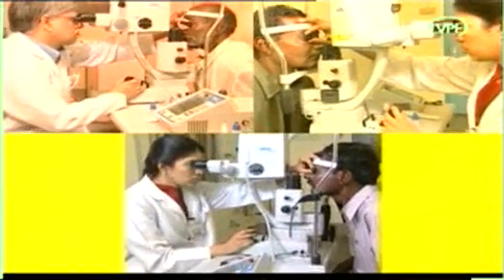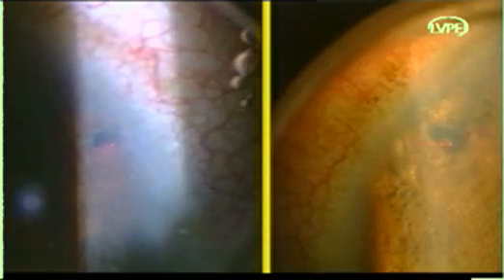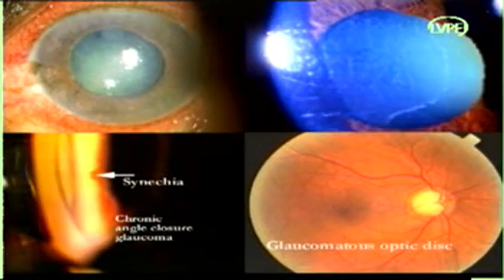In this video, we have seen the use of ND-YAG laser for iridotomy in the treatment of angle closure glaucoma. Understanding the principles involved in laser iridotomy and a timely diagnosis will help us treat a large number of angle closure glaucoma patients.